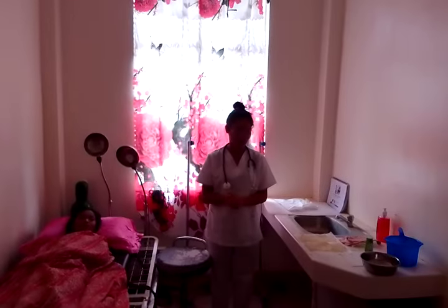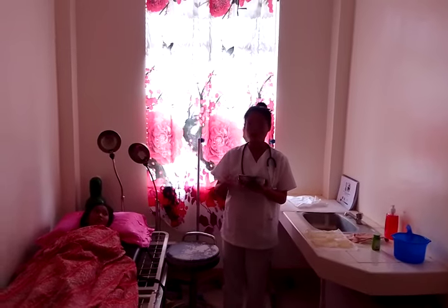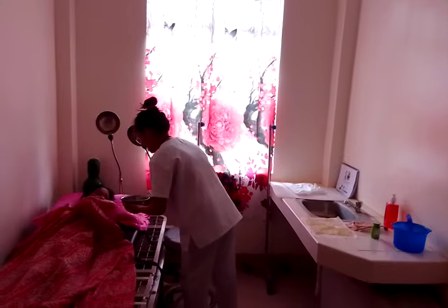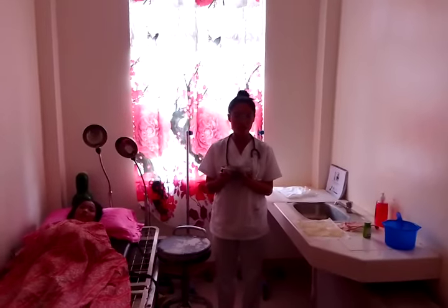Before washing, check the water temperature for safety and comfort, and ask the client to verify the comfort of the water. I will get the water and check if the temperature is appropriate — not too cold and not too hot. Is the water temperature okay for you, ma'am? Yes, it's okay.